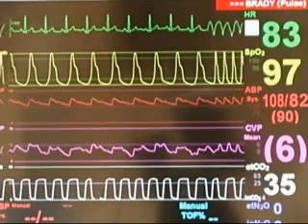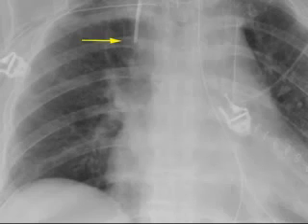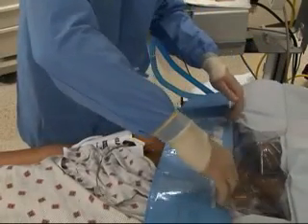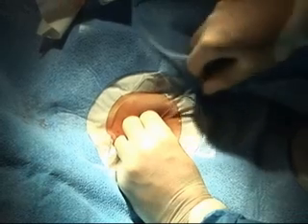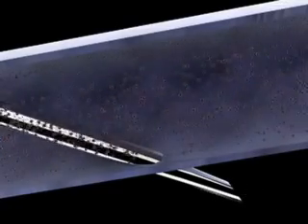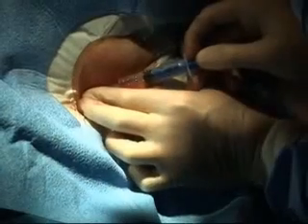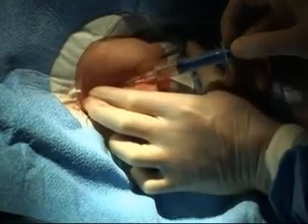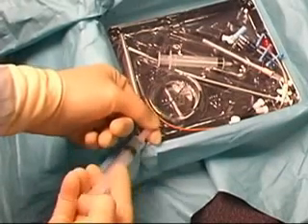If arrhythmias are seen on the monitor, the line may be in the heart, in which case the line will need to be pulled back. By approximating the necessary length of the wire before catheterization and confirming its placement with a chest x-ray, this problem can be avoided. Always be sure to work within a sterile field when placing a central venous line and to keep the site clean after placement to prevent local or systemic infection. If the wire will not thread through the needle, you may need to adjust the placement of the needle since it may have inadvertently been advanced during manipulation. Adjust the needle and re-aspirate to be sure that you are still within the vessel. If you are unable to re-establish blood flow, remove the needle and start over. If the vein has been difficult to cannulate, the presence of a clot in the needle will further complicate assessment. In this circumstance, remove the needle and flush it thoroughly with saline to clear it before re-attempting placement of the line.